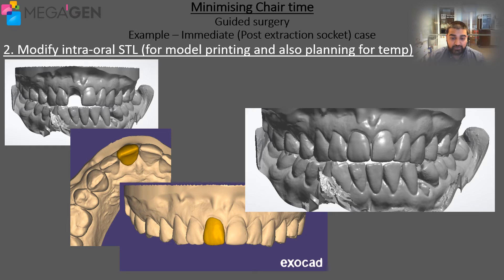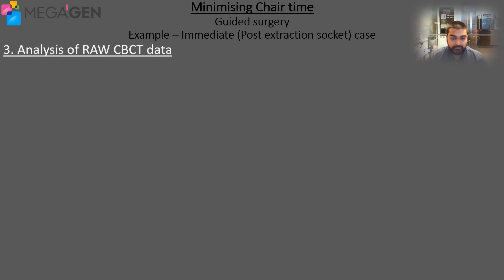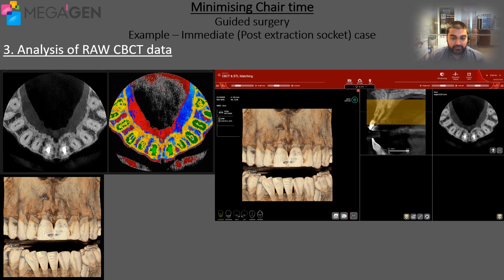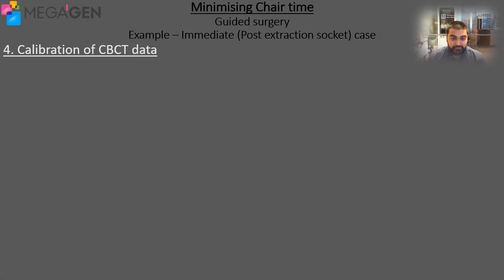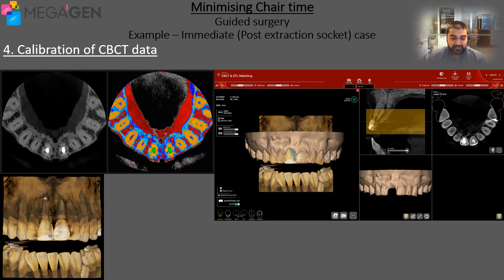Another thing that we need to do is to design a wax up to match the aesthetics of what we are trying to achieve. Now that we have modified the digital model, we can then move on to calibrating the Hounsfield units within the CBCT. This is the CBCT before calibration and this is the CBCT after calibration. You can see that I have also merged the digital model and the wax up to the CBCT in the software.